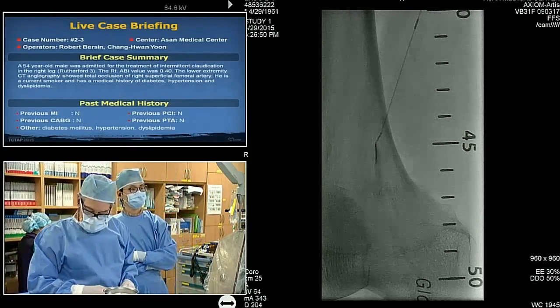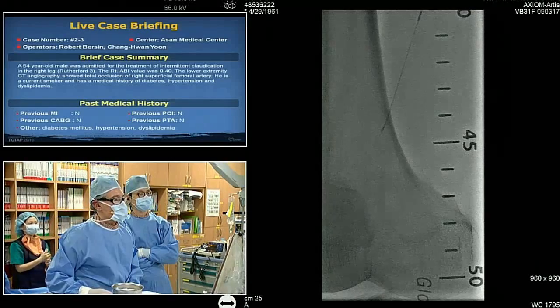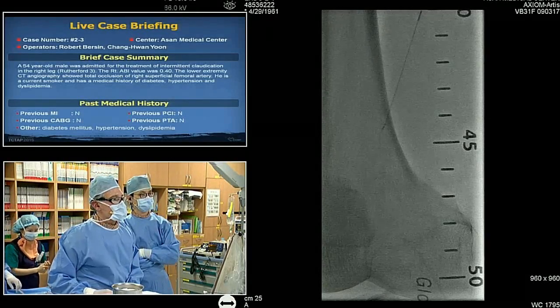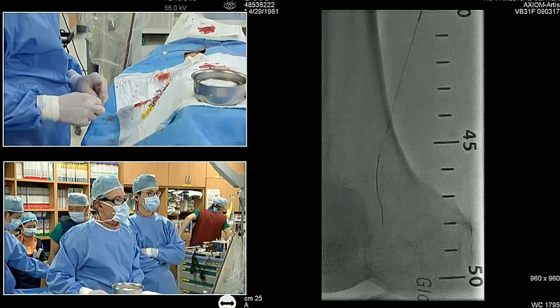In Japan, actually, just balloon and stent. So SMART, Misago, or Zilver PTX. That's it. We have no good debulking device in Japan, right? So just balloon and stent.